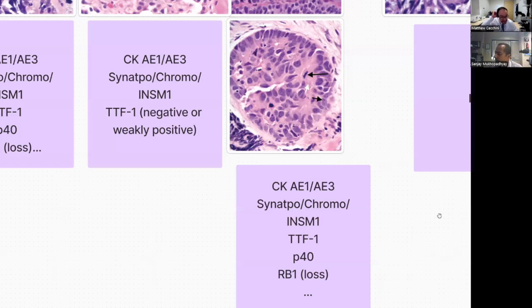Totally agree. This is great advice you gave just now, Matt, about on a biopsy. If you're not 100% sure, just step back to the less committal call, call it carcinoma or carcinoma with neuroendocrine features or high grade, something that covers both entities, and then outline your differential in the comment. I think that is okay if you don't do it all the time. If you do it for an occasional case, it's very much a reasonable approach.